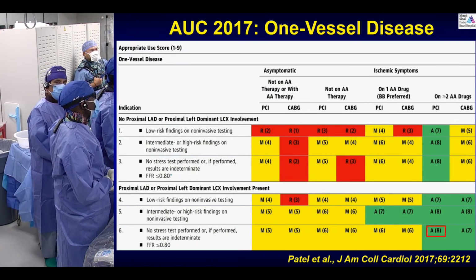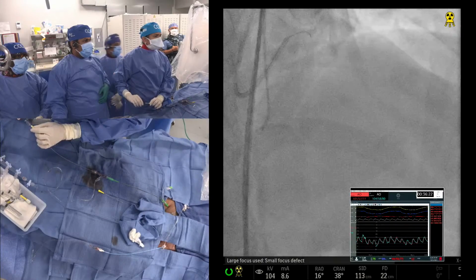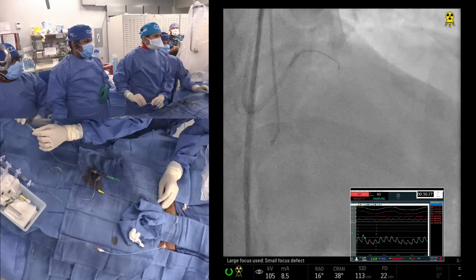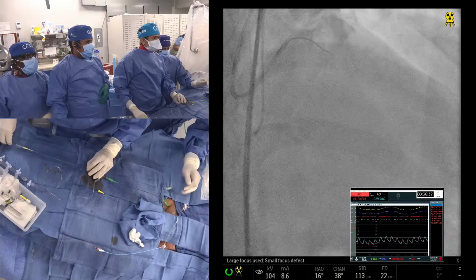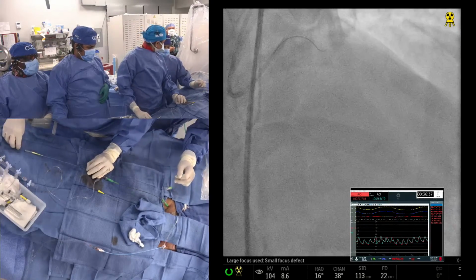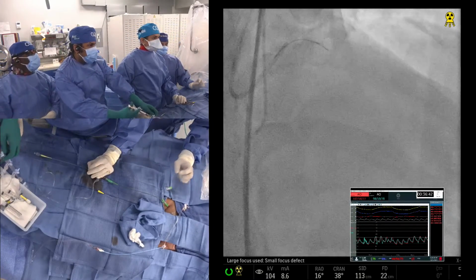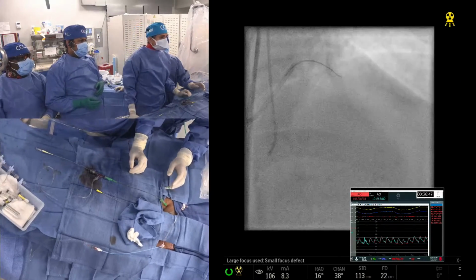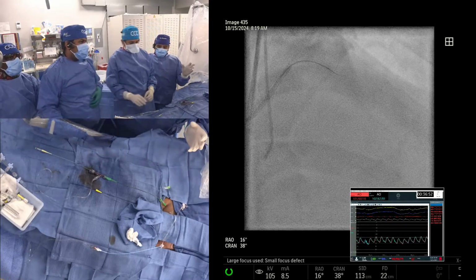Let's go on fluoro again. Okay, so we are coming with a Fielder and Fine Cross. With the modification in the calcification, the J-CTO score of course changes. So J-CTO becomes 3, because that angle is there, it's a very small stump, and whether it's a blunt cap or an ambiguous cap. If it is a clear cut tapered cap, then it becomes 2. But here I think it is a little better with the guide.